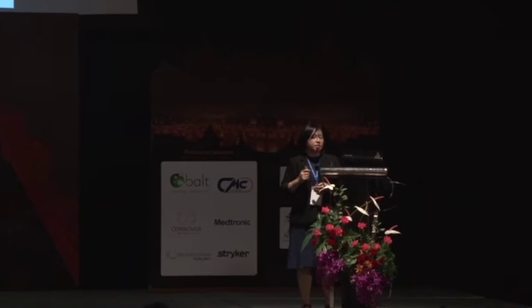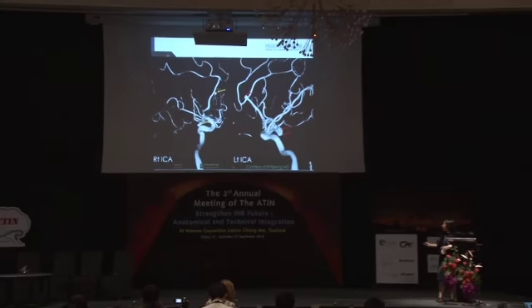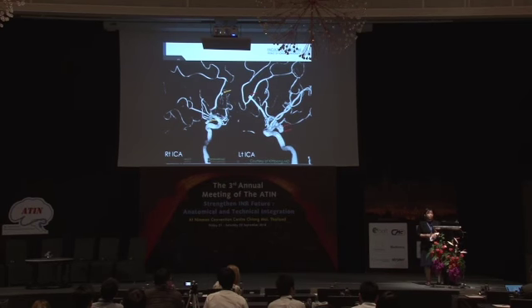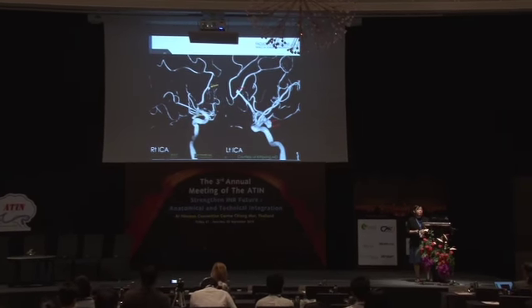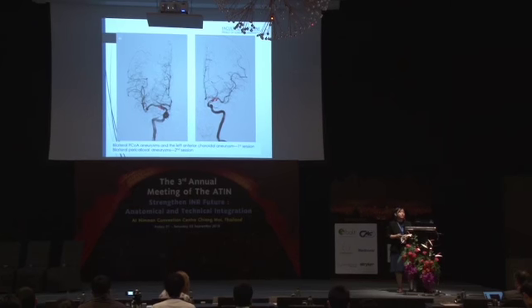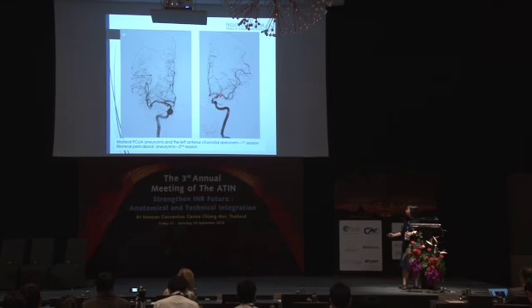Like in this patient, a 49-year-old male presented with diffuse subarachnoid hemorrhage. He was found to have 5 aneurysms on the 3D angiogram, including bilateral PCOM aneurysms, a left anterior choroidal aneurysm, and bilateral pericallosal aneurysms. It was unclear which aneurysm was ruptured because of irregular shape found at bilateral PCOM aneurysms and the left anterior choroidal aneurysm. These 3 aneurysms were treated by coiling in the first session, followed by a second session at bilateral pericallosal arteries.